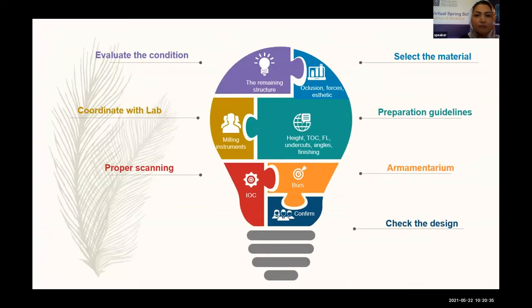In conclusion, I can summarize the whole process as you can see. First, evaluate the patient's condition. Select the material. Communicate with your lab. Perform the preparation according to guidelines with appropriate armamentarium, and then do a proper scanning. And finally, be sure to check the design.